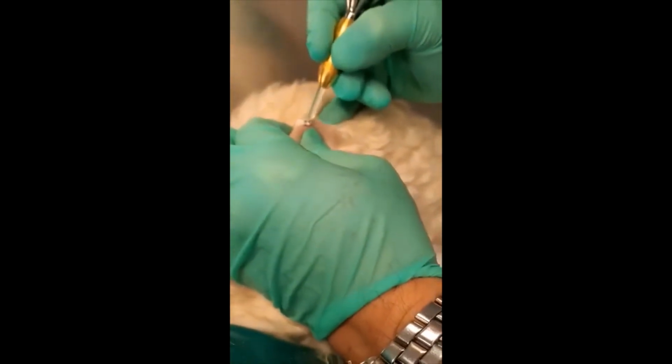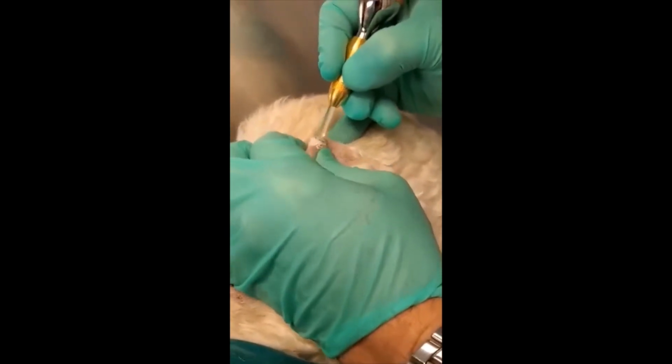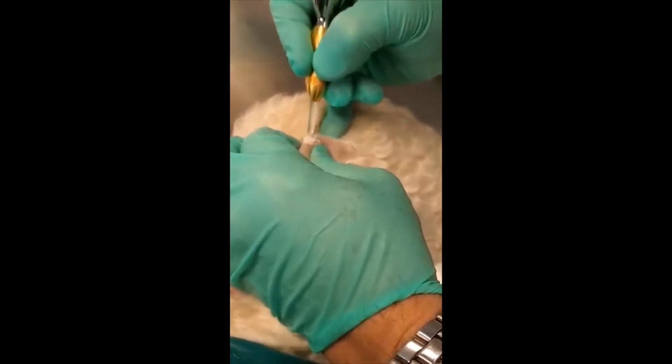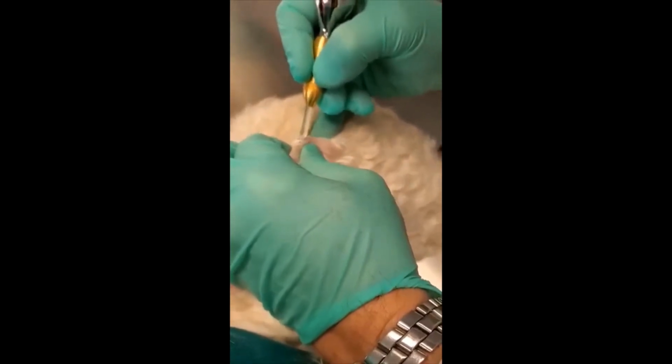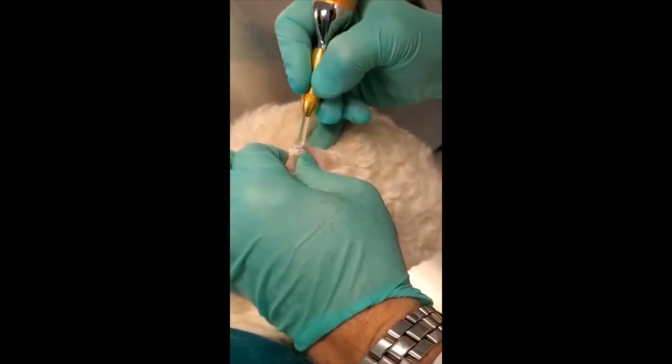Again, I'm knocking these crystals off as I freeze. We're going to do a 30-second freeze cycle, followed by a thaw cycle and a refreeze. Heather, how are we doing? 5 more seconds.